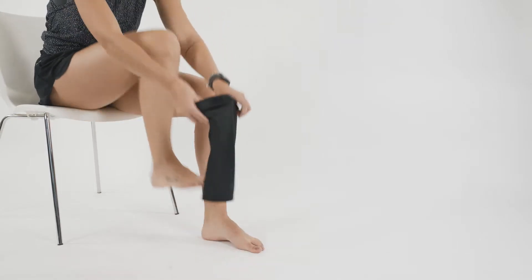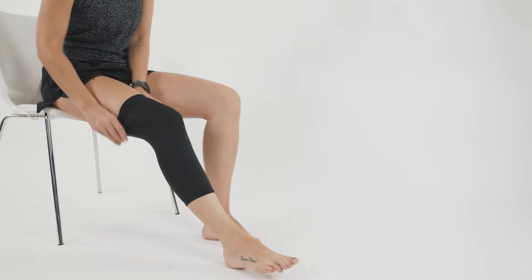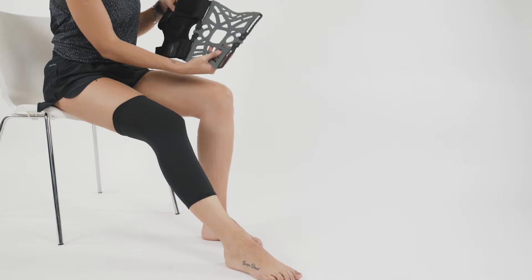The brace itself comes in two components: you've got the undergarment or undersleeve, which provides extra compression to the knee joint and helps protect the skin against the knee brace, and then you've got the knee brace itself.